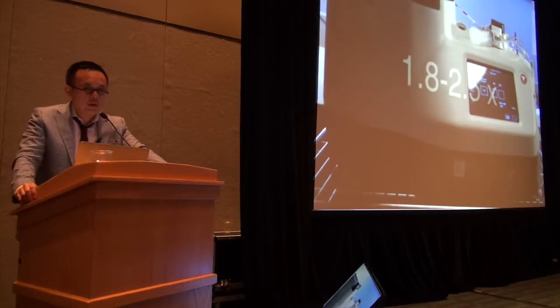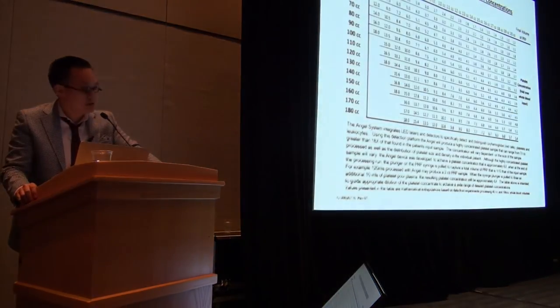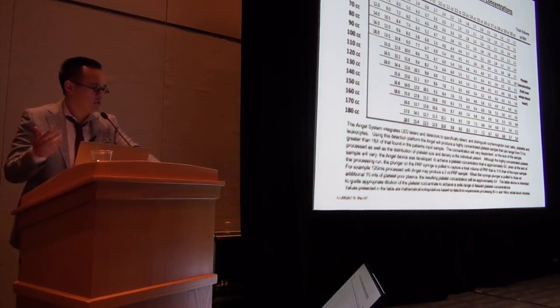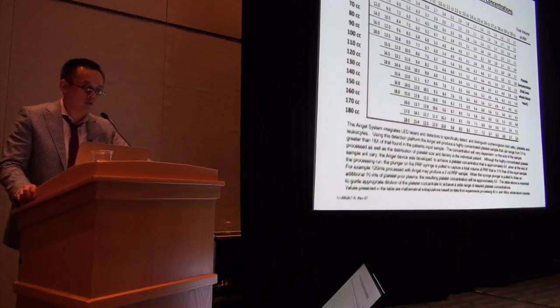The key with PRP is that you really want your platelet concentration to be around 2x above physiologic levels, because there's a drop-off point of efficacy when you are outside of that range. The way the Angel system allows you to do that is this very confusing chart, which is not meant to be memorized, but I pull 60 cc's of blood out. I actually pull 120 cc's, but they're in 60 cc vials. And you see the 2x of that 60 cc line is around 18 cc's. So I get about 35 cc's of usable product, which is really helpful.